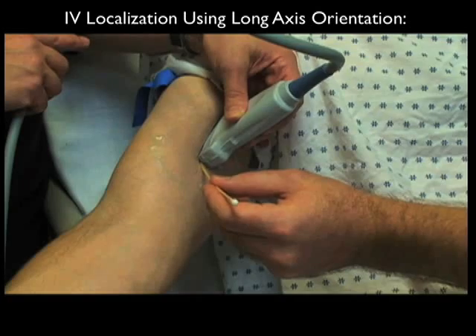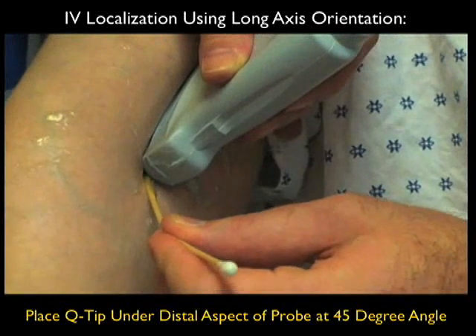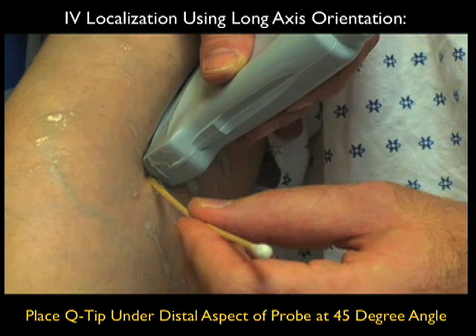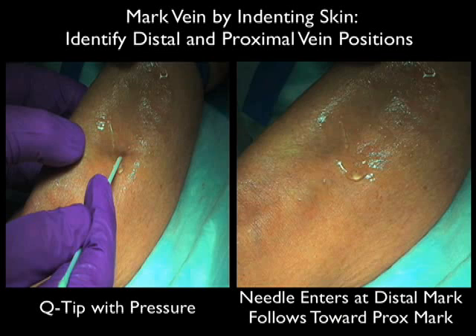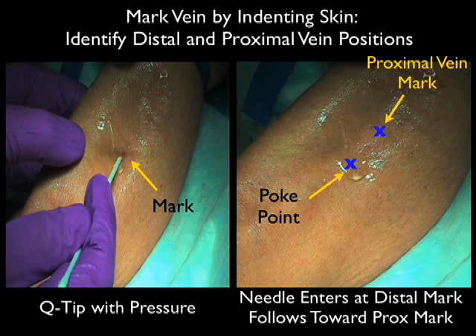We can also localize a vein using the long axis orientation, which is helpful for two things. First, it allows us to determine the course of the vessel; and second, we can see the needle depth as it comes into the vessel. Notice here we're placing the Q-tip under the distal aspect of the probe. It's crucial to aim the needle along the long axis trajectory of the vessel so the angiocath will enter the lumen. We'll first mark a distal poke point using the short axis ring-down artifact, pushing down with a Q-tip right over the vessel and marking it with a sharpie or pen. We'll then move the probe a little more proximally and mark a second poke point, so the needle enters at the distal poke point and is aimed towards the proximal vein mark to best enter the vessel lumen.